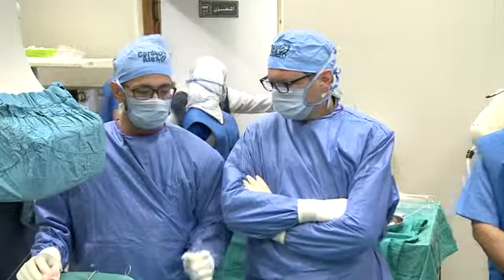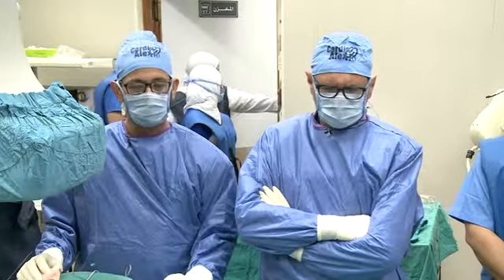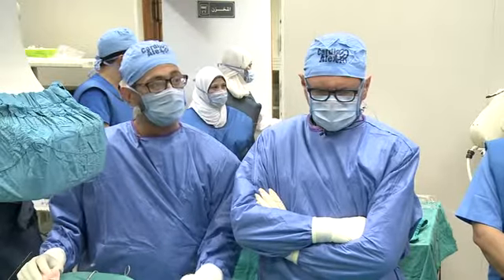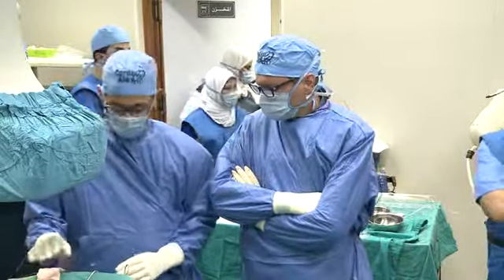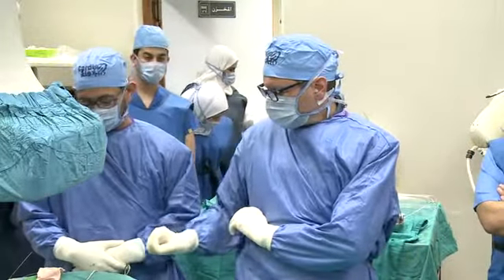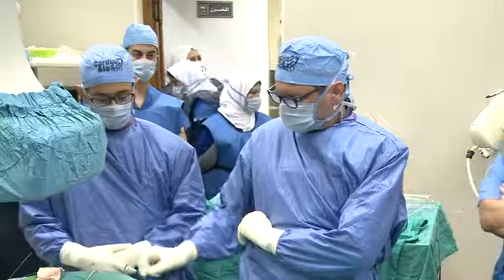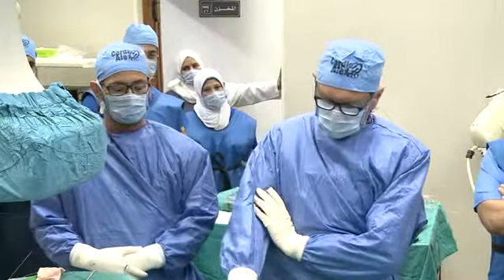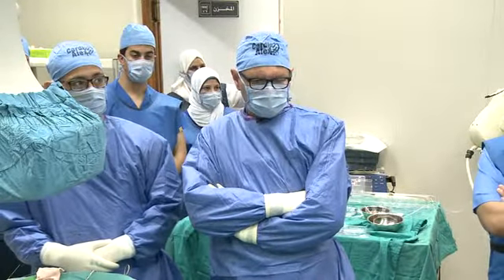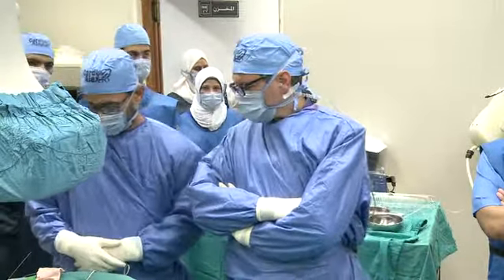It's my pleasure to introduce Professor Peter to comment on our plan in this patient as regards the strategy and what we have done up till now. Okay, thank you, Dr. Ali. So up to now we've gained access. We have 3 accesses here, and through a safe sheath, we have a long CS sheath, and through that a diagnostic catheter with a lumen now in the coronary sinus. We have already implanted the RV lead.